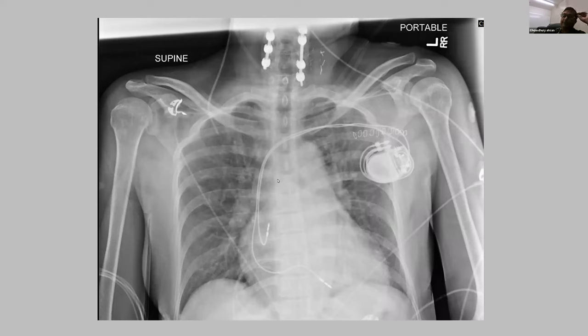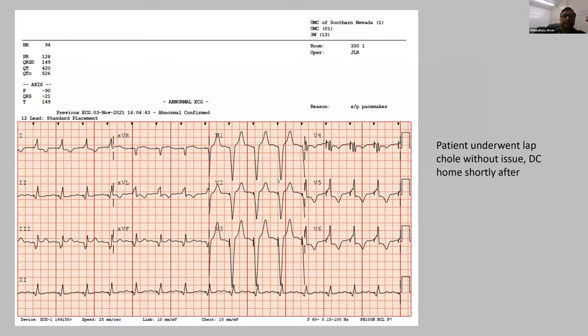So sometimes it is the company you keep. The right bundle and the left posterior hemiblock, there is significant conduction system disease. And in the face of that, this bradycardia, we gave the pacemaker. And after the pacemaker, this is the rhythm, the sinus and then paced. So does it help you to understand this was infranodal or nodal?